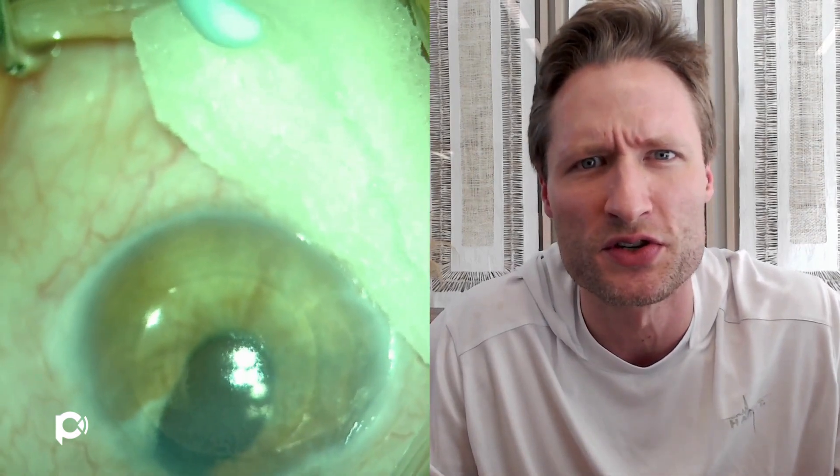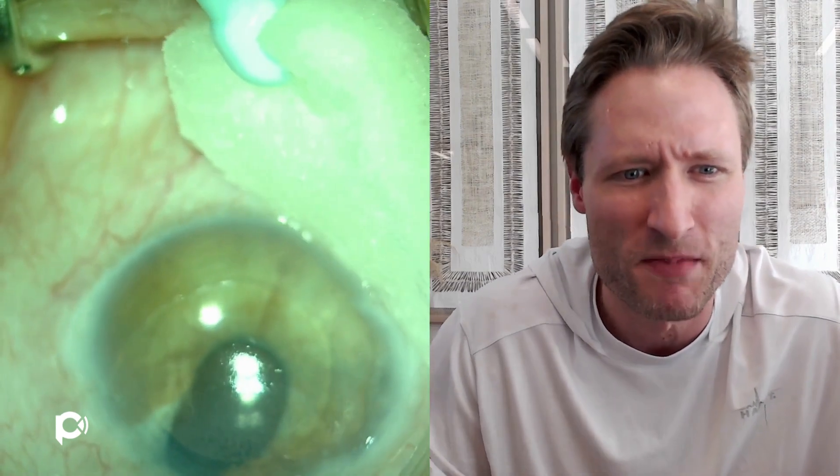This is a case done just a few days ago — an eye with an ACIOL from prior complicated cataract surgery. Here we are on the operating room table. I'm administering my preferred anesthesia, which is a subconjunctival injection using a medication called Exparel — liposomal bupivacaine. It's a sub-Tenon's block that lasts three days, keeping the eye comfortably numb post-procedure. I really like that because it keeps my patients a lot more comfortable than they would otherwise be.